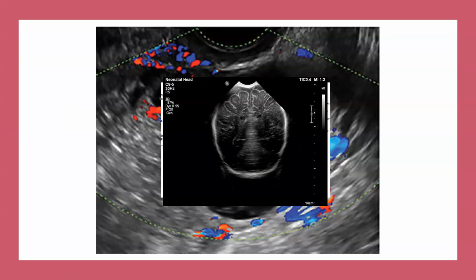So these are the extraaxial spaces. This is kind of the pia layer. You can see, again, there's going to be attenuation of sound. Naturally, because there's attenuation of sound waves, these areas appear darker. But the lining itself, there's a difference between the acoustic impedance of the pia and the tissue underneath, so the pia actually appears quite bright. And as soon as you come to the ventricular system, again, slight brightness, there's attenuation, so less bright than the pia because sound waves have attenuated by the time they've reached here.